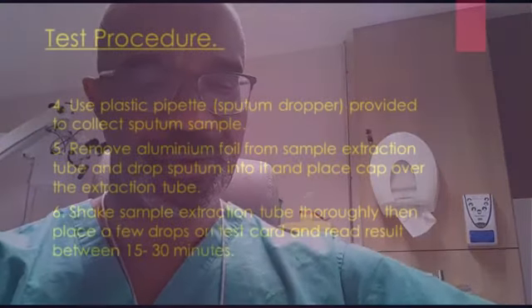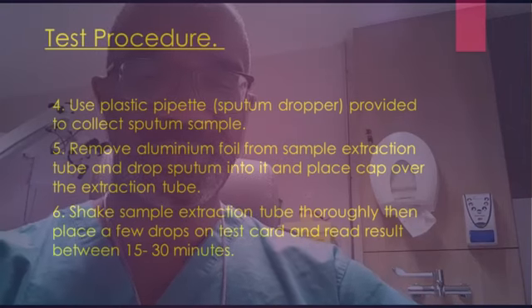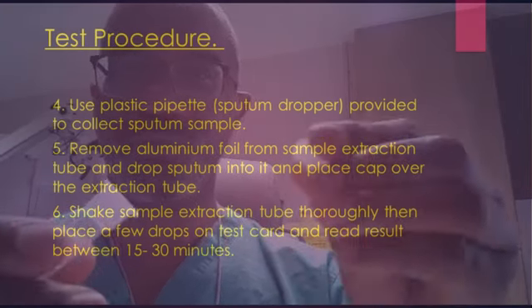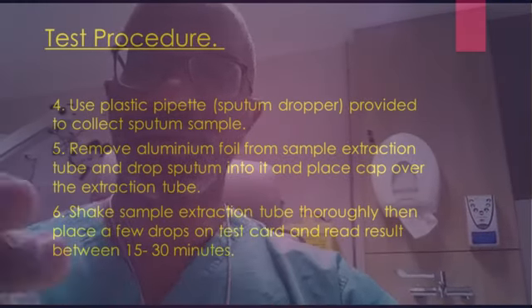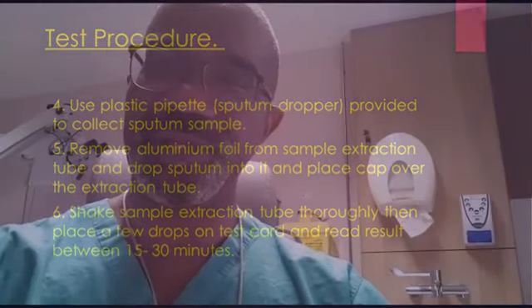And this comes with a cap from the manufacturers. So once you fill that, you apply the cap. It fits like that, and you give it a good shake. Make sure it mixes properly.